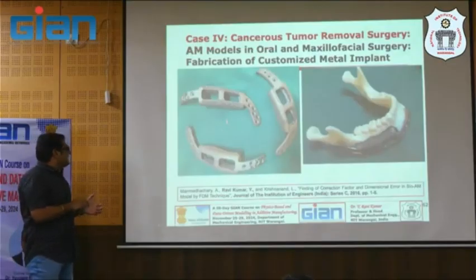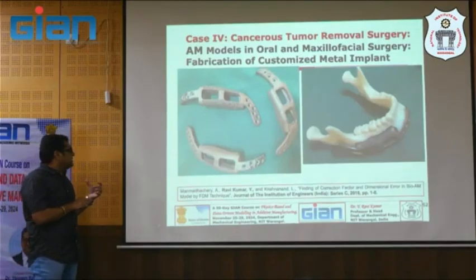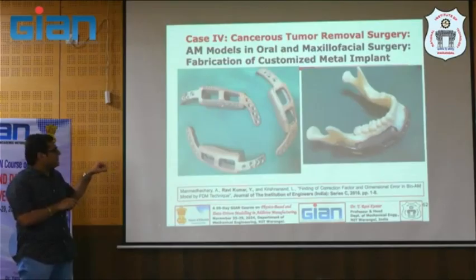So in this case, again we are taking the help of lattice structures. That's what we discussed in the previous discussion also. These lattice structures, again, are patient specific, which we are trying to mimic. And it will serve both purposes. One is lightweighting, another one is osseointegration and cell growth, right? So that will be taken care of here.